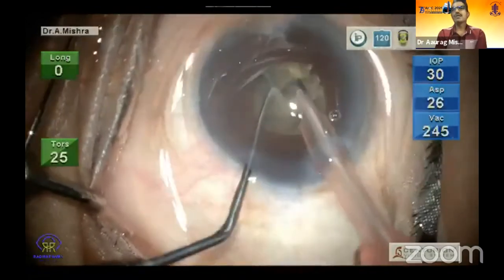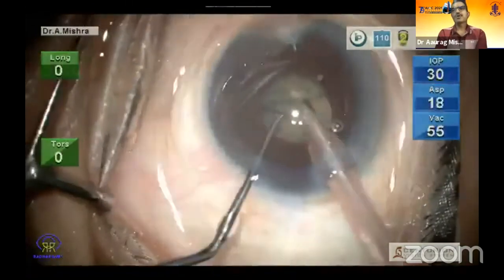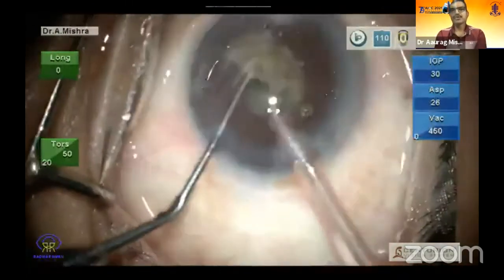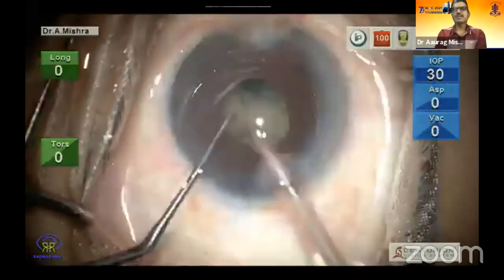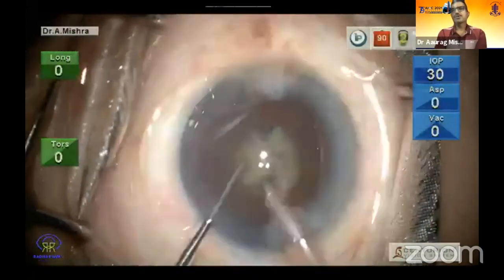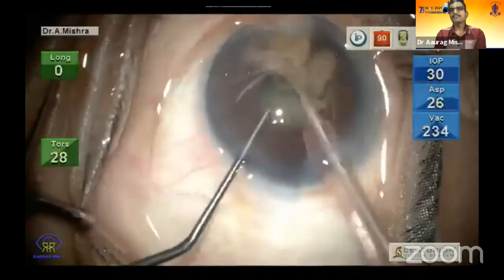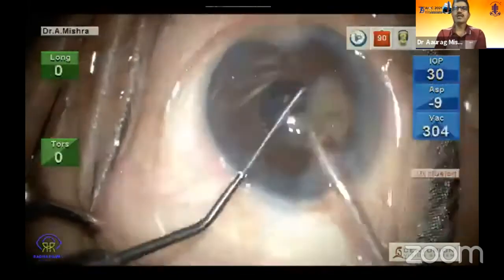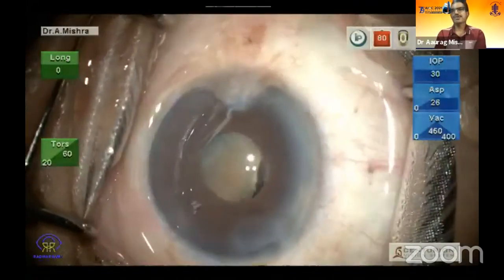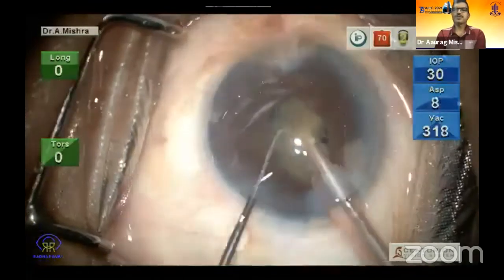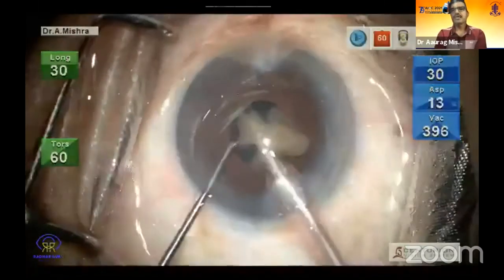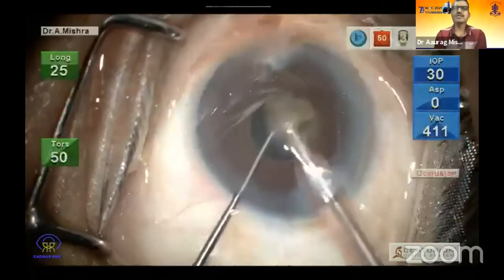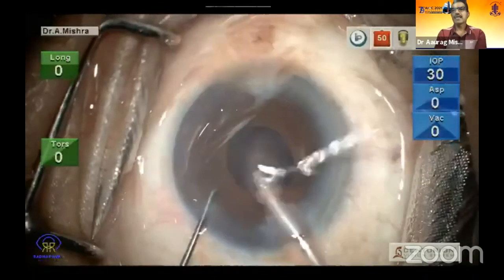At times the posterior plate does not budge and does not give a clear cleavage, but we keep cartwheeling and chopping — at some point it will crack. The IOP remains at 30 with no chamber instability whatsoever. The pupil is perilously small, but staying at the center and walking inside the bag is achievable with practice. When the CDE reaches around 15 to 20, I stop and refill the anterior chamber with dispersive viscoelastic for additional endothelial protection, then continue. Staying at the center ensures the pupil is not engaged in the phaco needle.